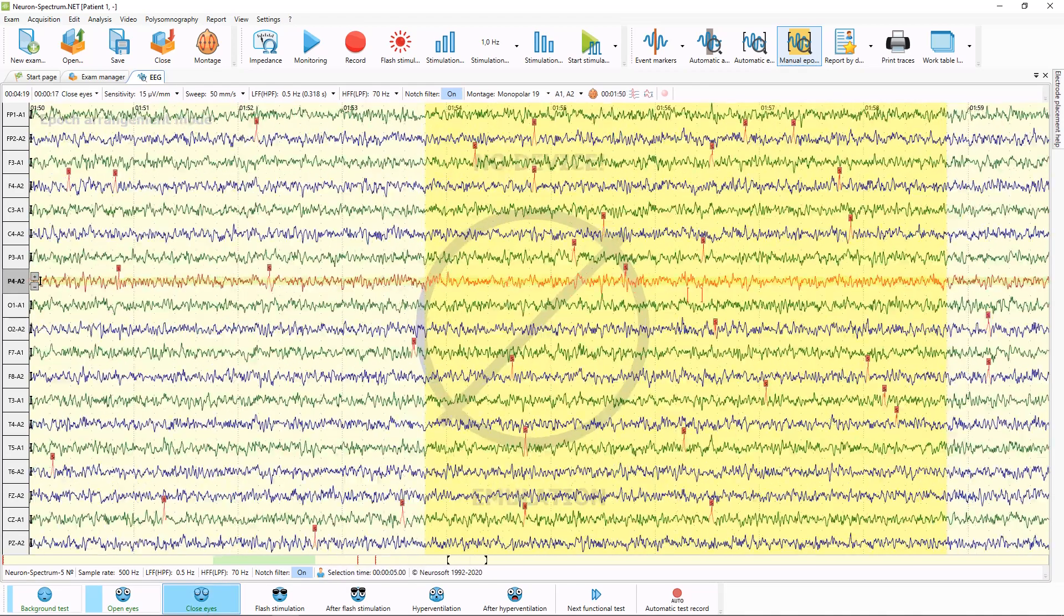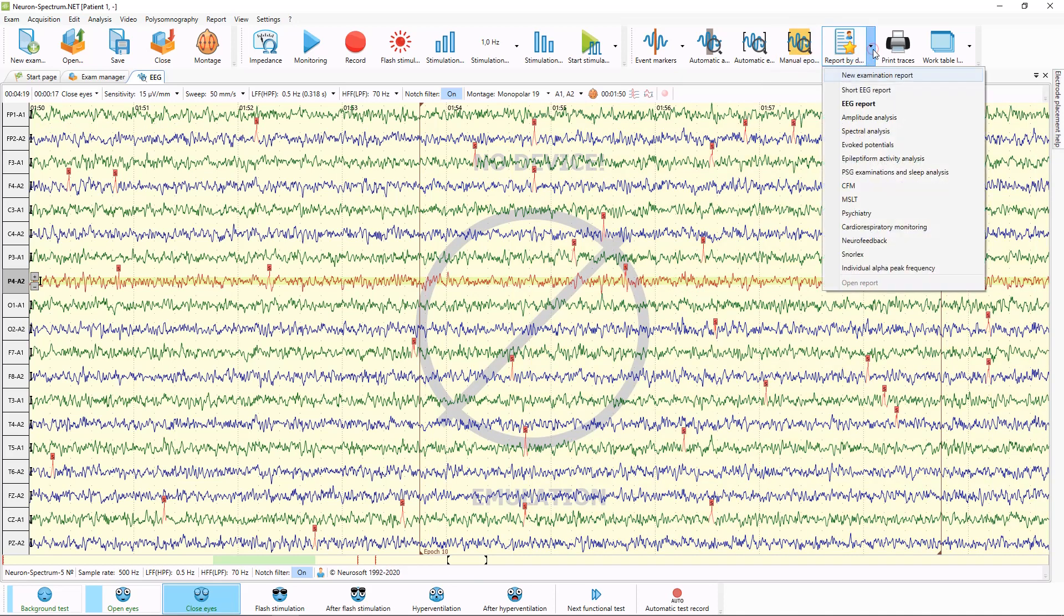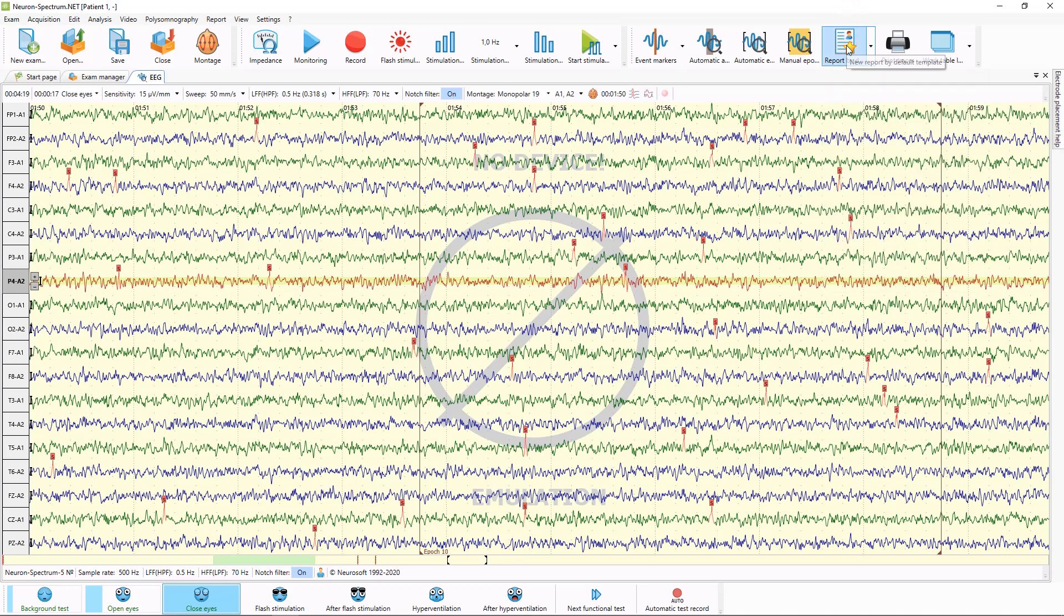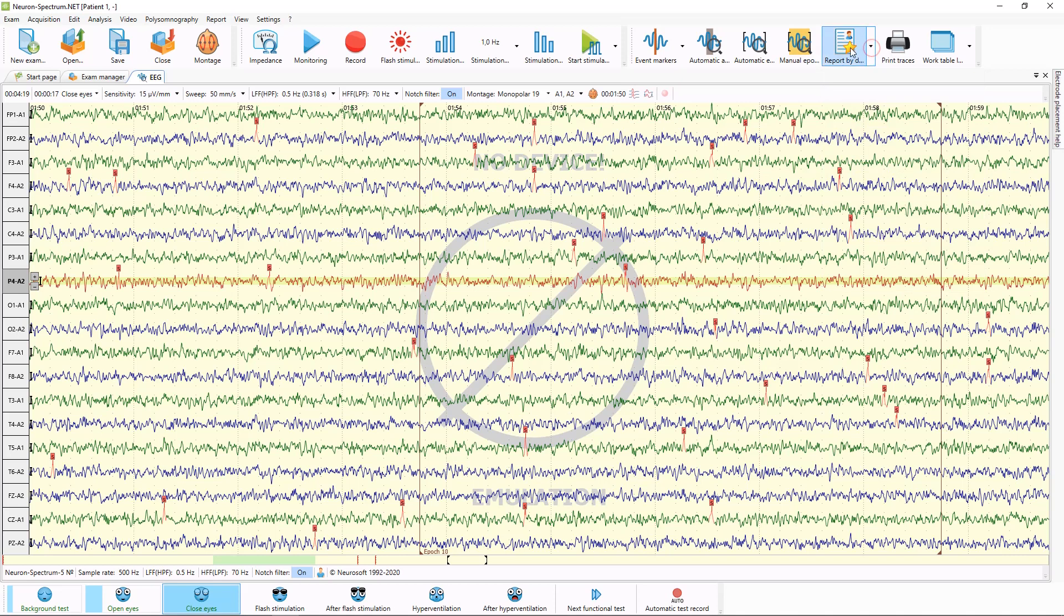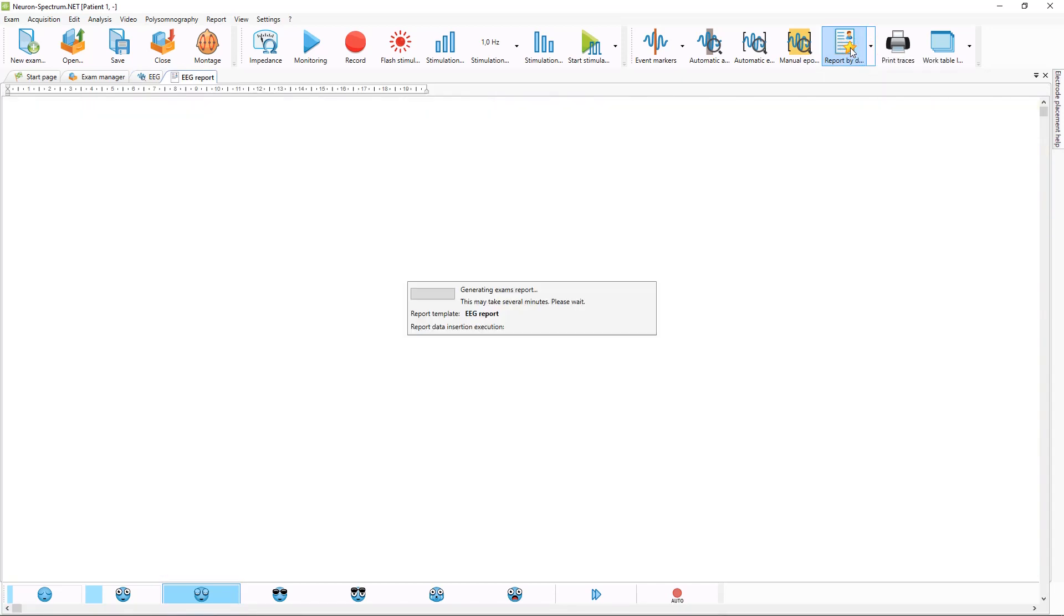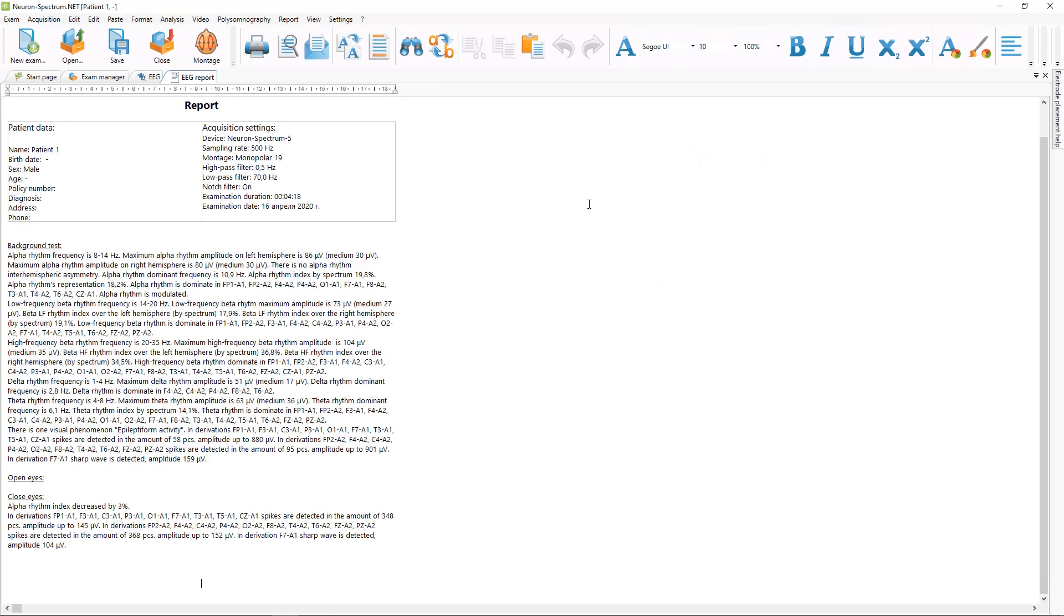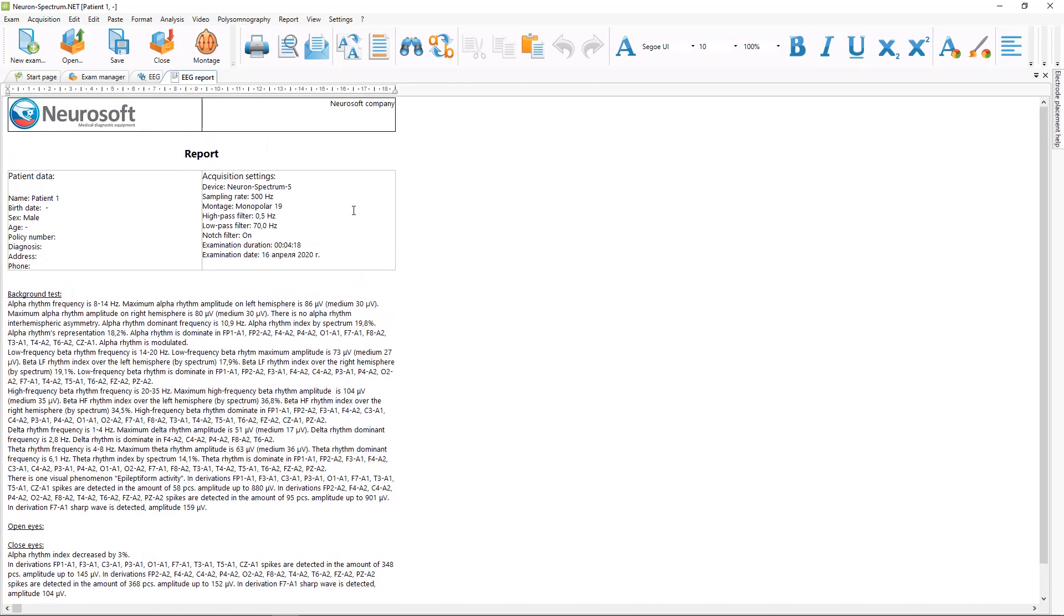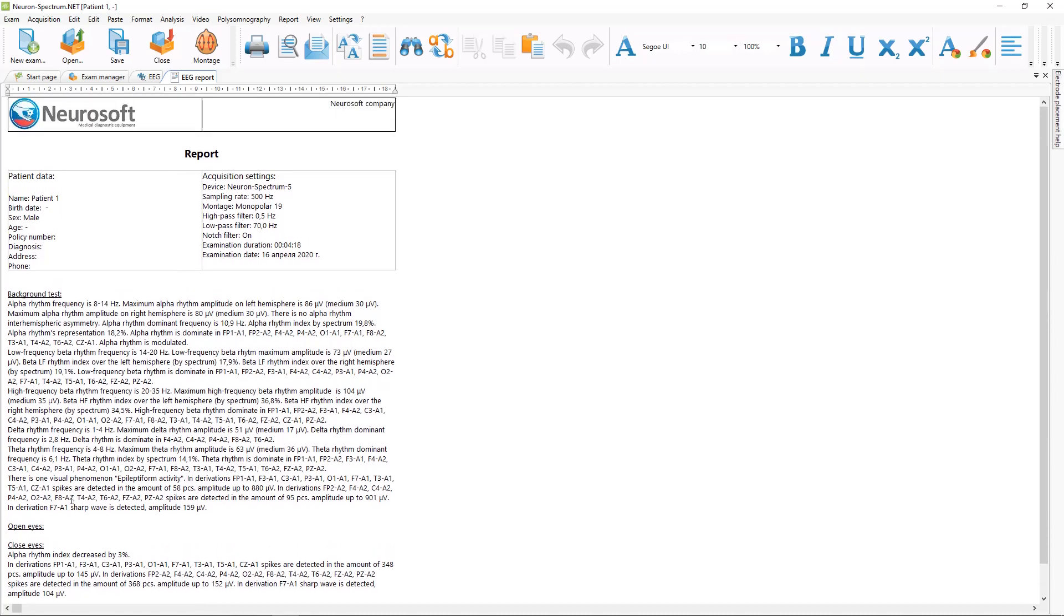When you place enough epochs, you can prepare report. You can select predefined report template from this list, or you can press this button and report will be created according to selected report template. For routine EEG examinations, it is the typical EEG report. You can see that report is generated automatically and include the title, the patient data, acquisition settings data and description of all functional tests which were recorded during acquisition. But also here you can type your own information with the keyboard.